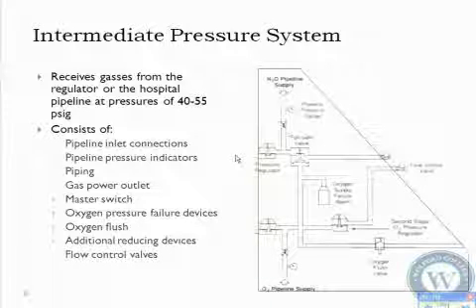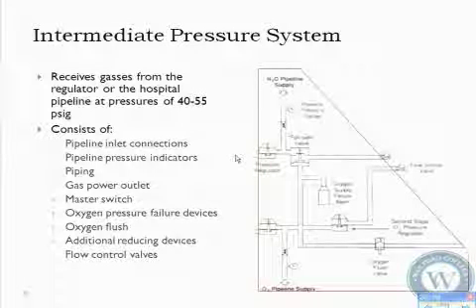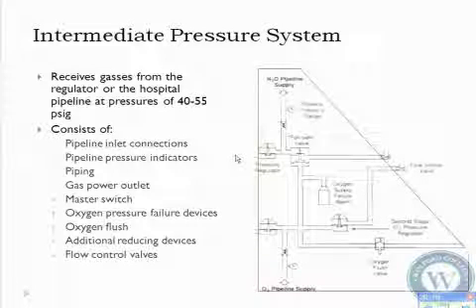One other thing you'll be taught is that you can use the O2 flush valve for transtracheal jet ventilation. If all else fails and you have to put in a crike, you have no other way to give transtracheal jet ventilation. This machine can't do it. None of our machines can do it. The only way is to push this, which the manufacturers do not recommend, but that's what you have to do, or some hospitals have a specific outlet for transtracheal jet ventilation in the ORs. You plug directly into that, with a little device, and then you are the jet ventilator.